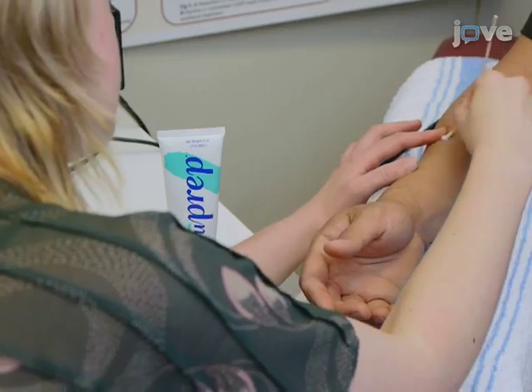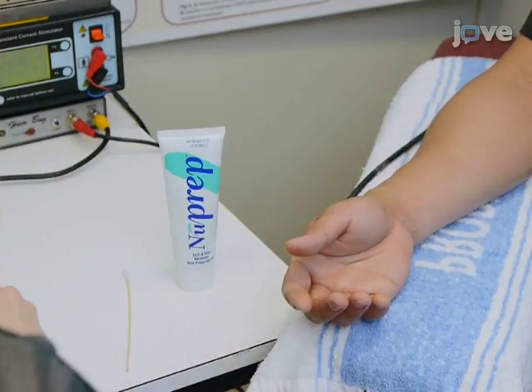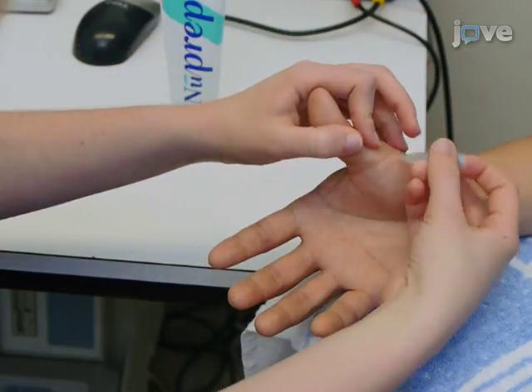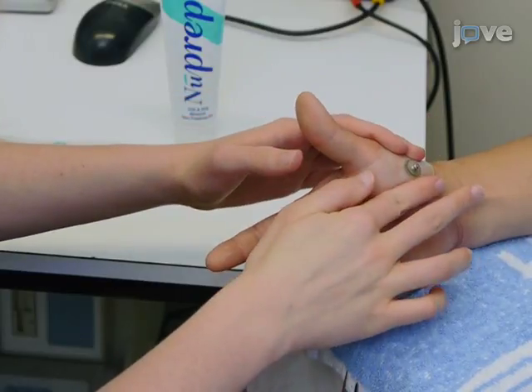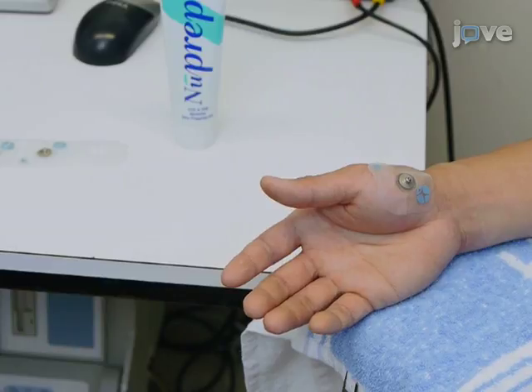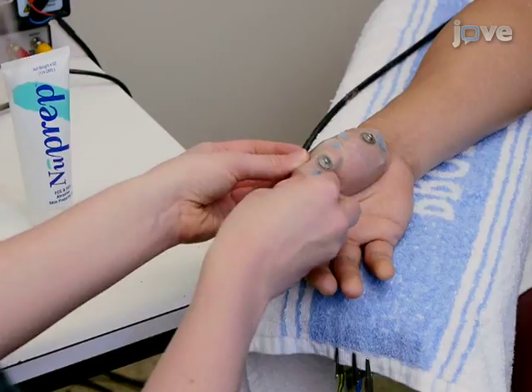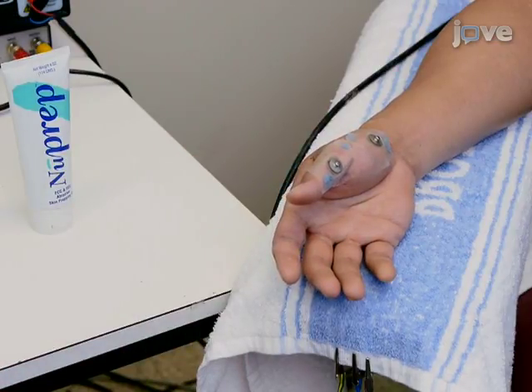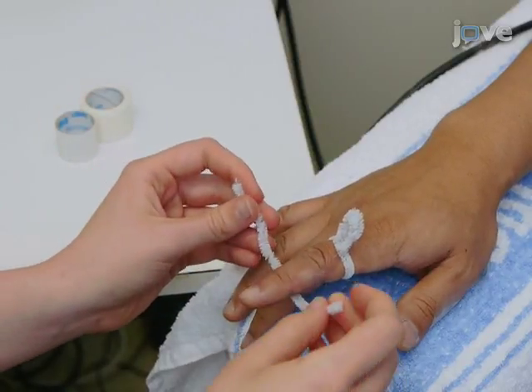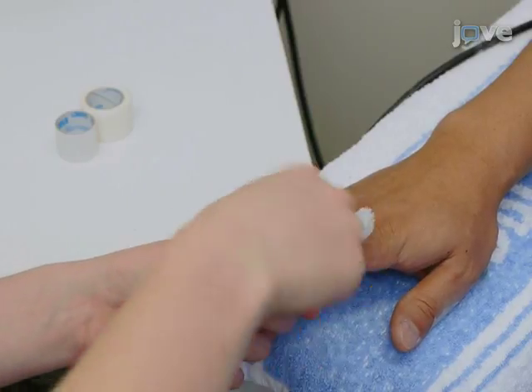Begin preparation by using an abrasive gel or pad to prepare the skin surface at the wrist and forearm to reduce skin resistance, then apply an alcohol wipe. Next, prepare the recording site for motor recordings by placing non-polarizable electrodes on the muscle belly of the abductor pollicis brevis. Also place a reference electrode 4 cm distal to this location to record compound motor action potentials. Now prepare the recording site for sensory recordings using ring electrodes placed at the proximal and distal interphalangeal joints as active and reference electrodes, respectively.